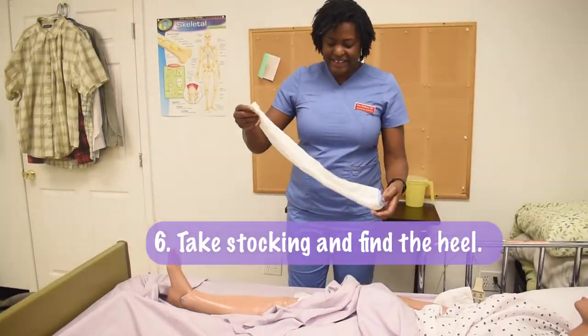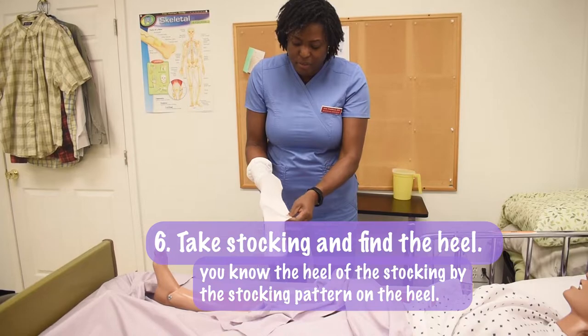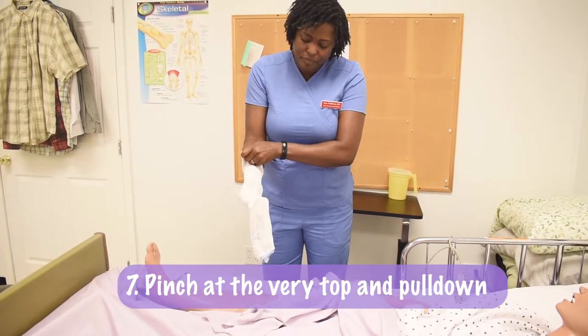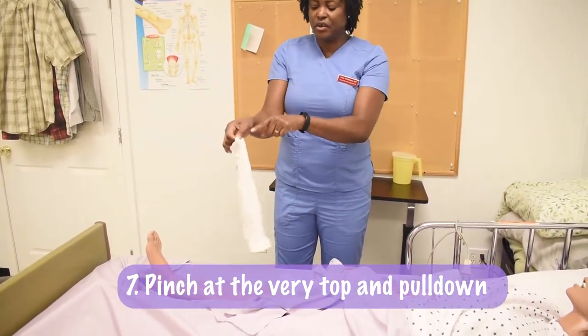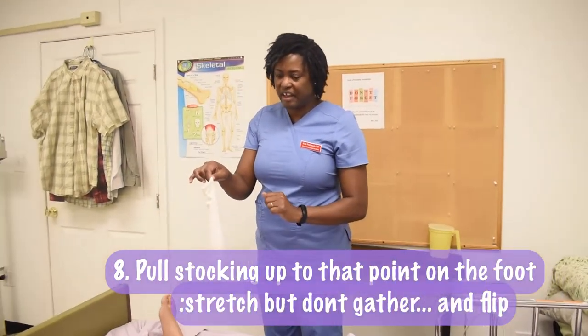I take the stocking and I find the heel of the stocking. You know the heel of the stocking because there is a different pattern on that heel. I pinch it at the very top and simply pull down. I know that this is the heel, and I only have to pull this stocking up to that point on that foot.